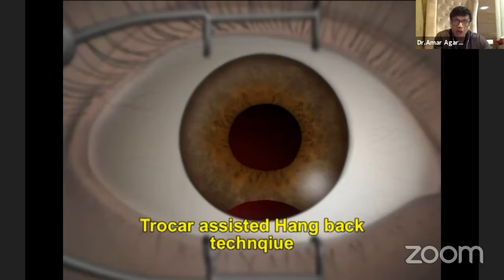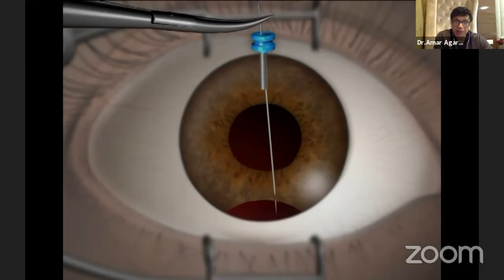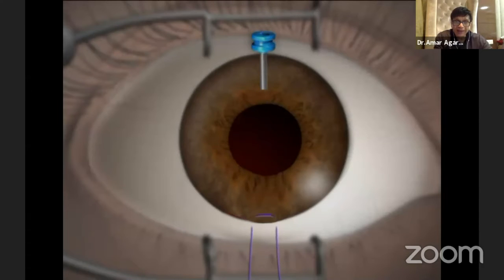So we started this new technique, which is a modification of Michael Snyder's hangback technique — it is called the trocar-assisted hangback technique. The problem in the hangback technique is you are going from the 6 o'clock position up to 12 o'clock with a double-arm suture, and invariably you'll get stuck with corneal fibers getting into the needle. So what we decided to do — and it's been published in the EJO — is pass a trocar. Once the trocar is in the eye, I pass this double-arm needle. It goes out and comes out like this. I use that 9-0 double-arm prolene suture, which is just fantastic. Once one loop comes out, you can see I'm passing the second one. All you need to do is pull and that is over.